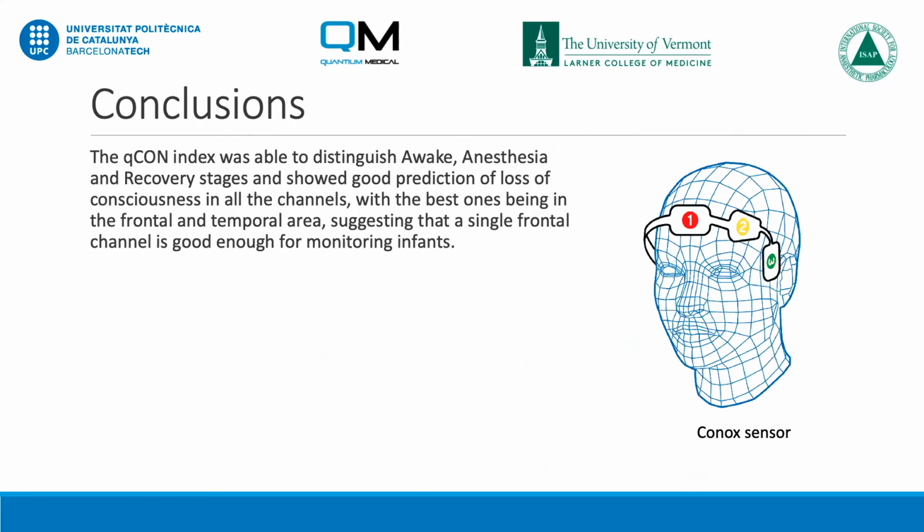So in conclusion, the qCON index was able to distinguish between awake, anesthetized, and recovery, and showed good prediction of loss of consciousness. The best ones being frontal and temporal areas. That suggests that it's possible to use a single channel for monitoring infants, but definitely more work and more data should be carried out before we can make a final conclusion, if we can make a claim that we can monitor down to very low ages, neonates in particular. Thank you for your attention.